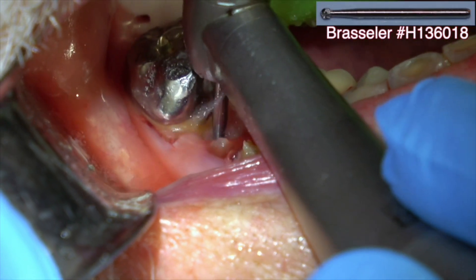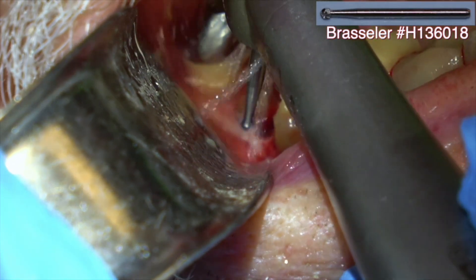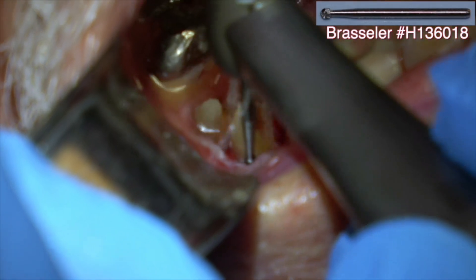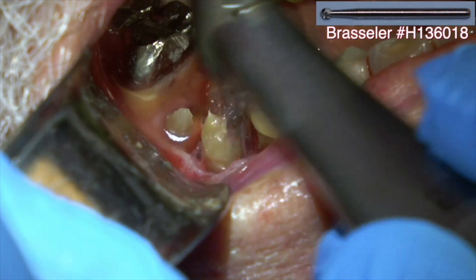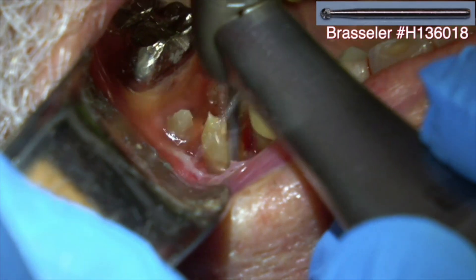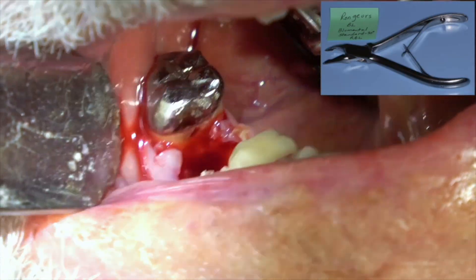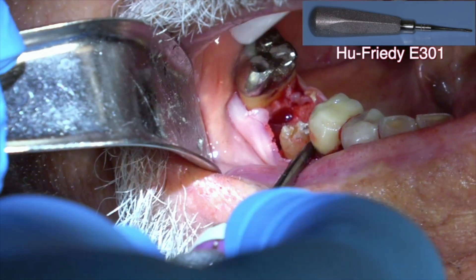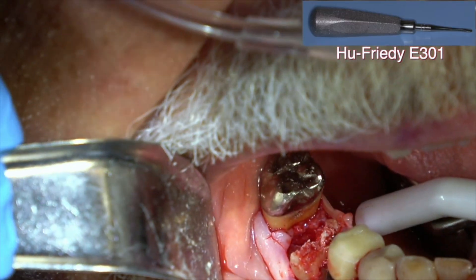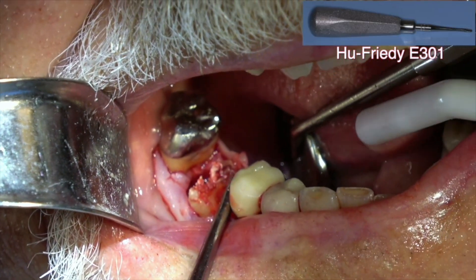These are bears — you know they're going to be tough because they're so brittle. To make it even worse, it's an elderly person who's had endodontics on the first molar and there's a lot of decay. Sometimes you just do what you've got to do to get the tooth out. I'm having to remove a little bone with a very small long-shank round bur, just to create a little space. And there goes the distal root. Now I've got space on the distal to elevate the mesial roots, treating them as one root. We're also extracting the second bicuspid, which has three roots.